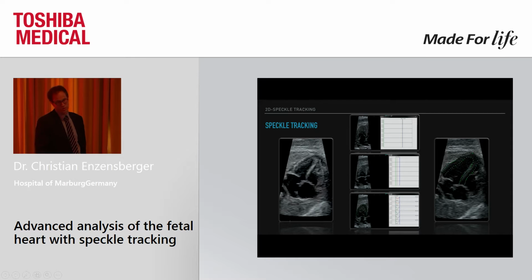Transversal view, we already tried to do it, and I think because of the lower lateral resolution, you should avoid this. Now, when you see the septum, it should be either between 11 and 1 o'clock or 5 up to 7 o'clock. This should be the range where you measure. Then, if you are interested in high frame rates, you should narrow your scan range to achieve them.